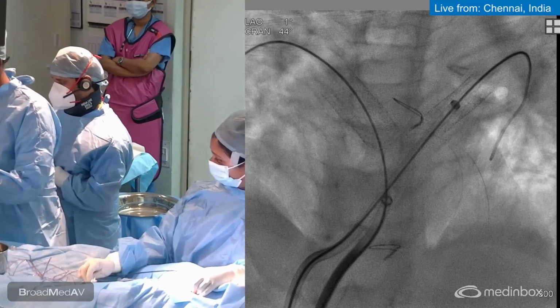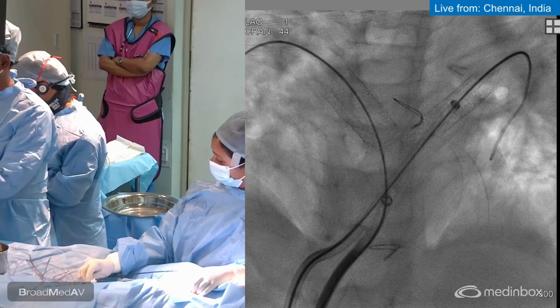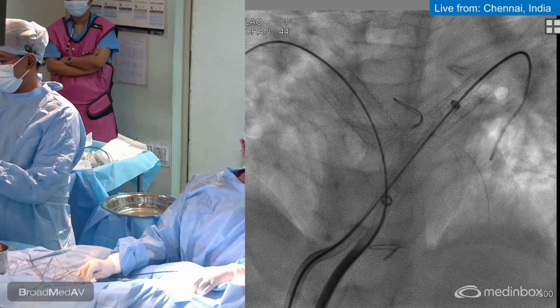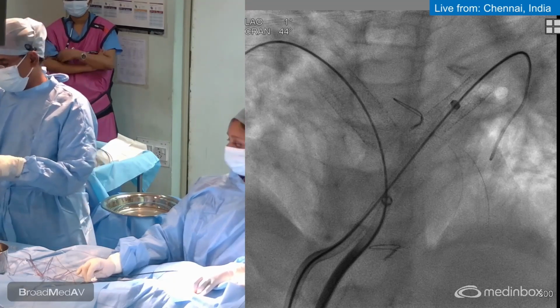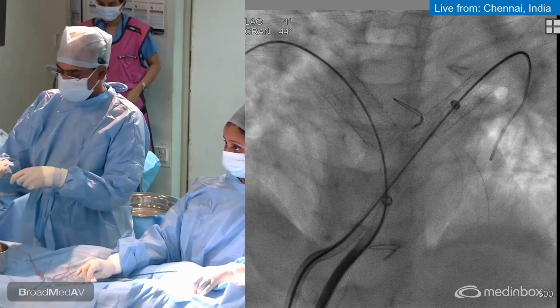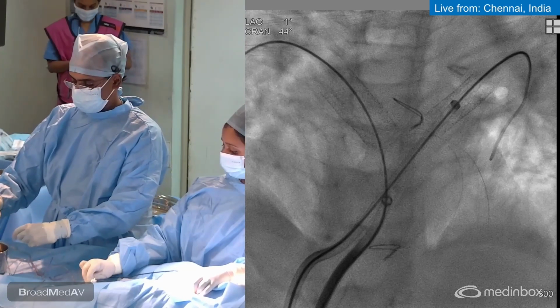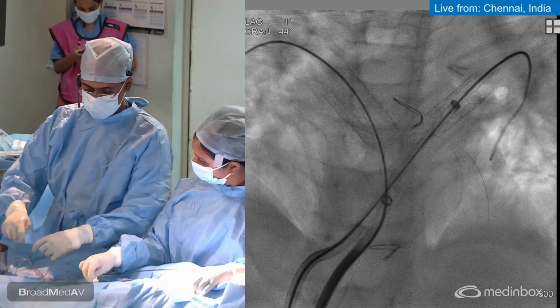So it's a 12 by 2. Central lumen flushed. Yeah, that's fine. I'll connect to the inflation device.